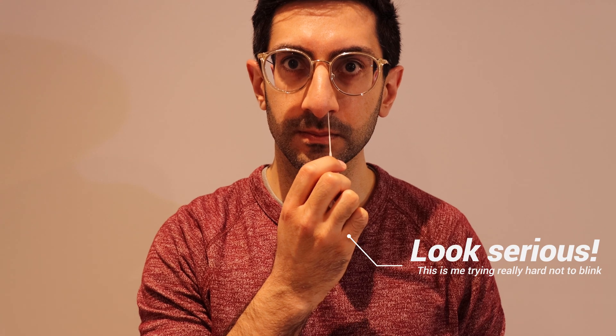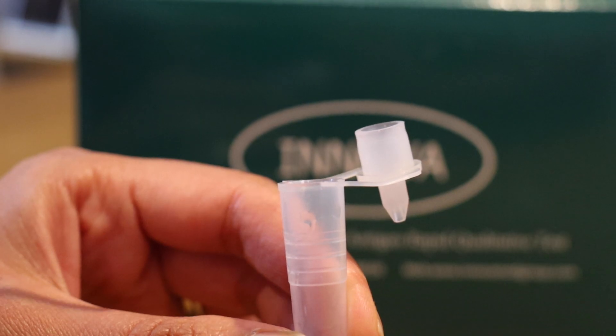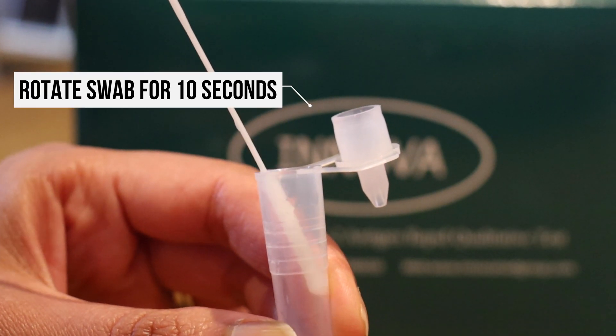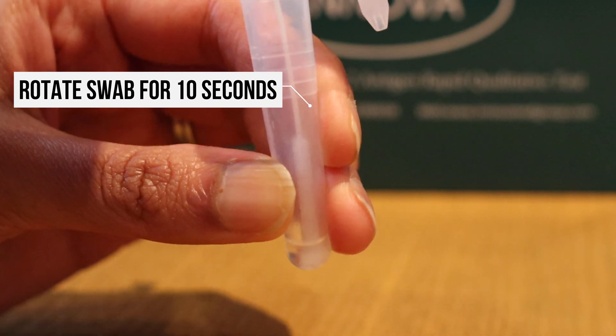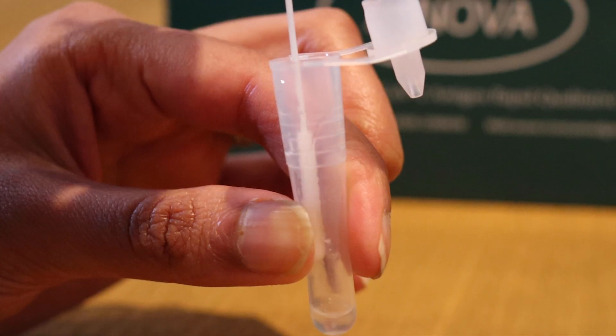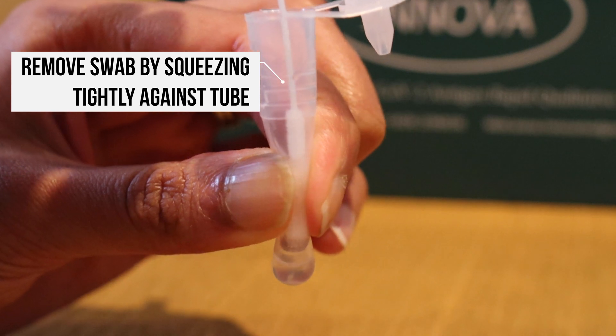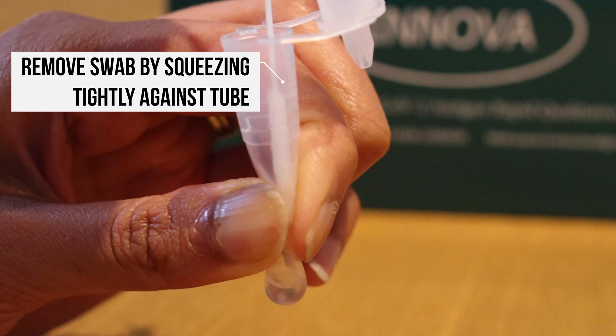This does feel a bit uncomfortable — don't worry if it makes you feel a bit funny. Put the swab into the dispensing bottle and rotate for 10 seconds, pushing hard against the solution and against the sides of the container. Then take the swab out, squeezing the bottle to make sure the extraction solution stays inside, and dispose of the swab.